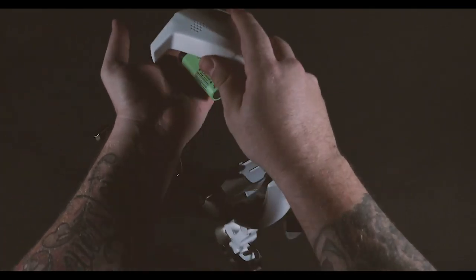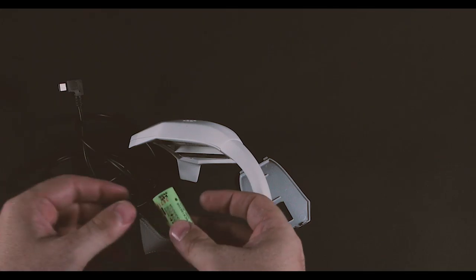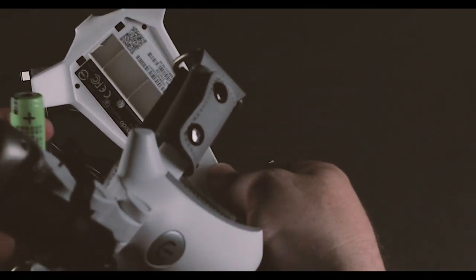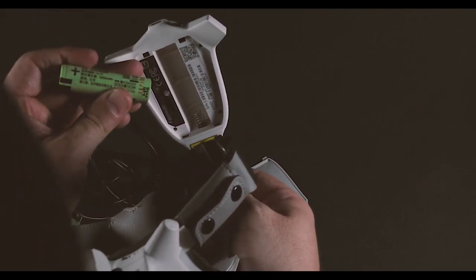Tap it out like that. You can take the new battery. You got plus side and minus side — plus goes at the top, minus goes on the spring.